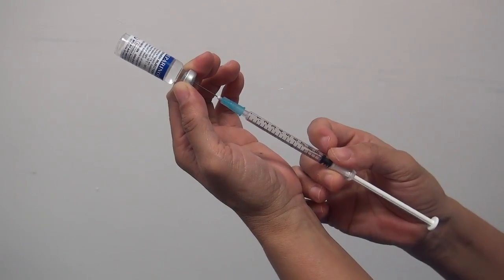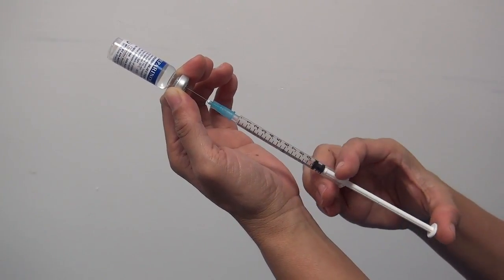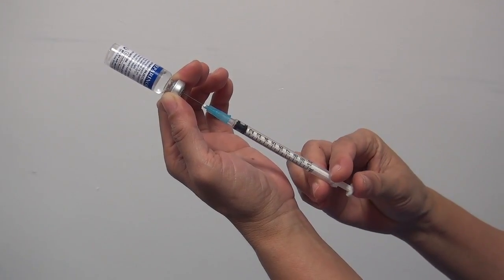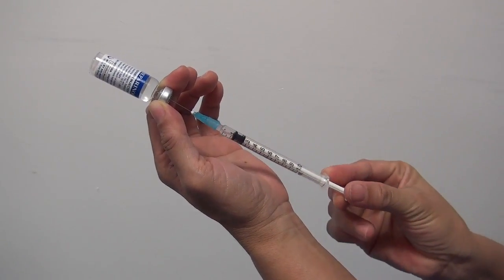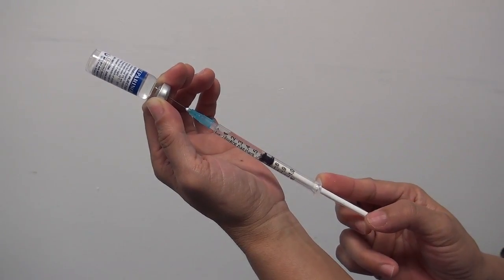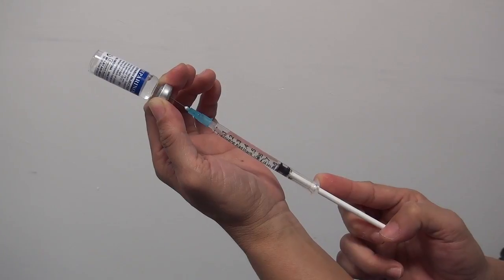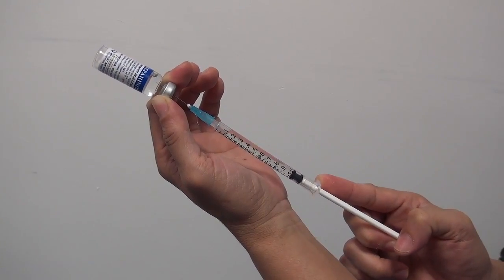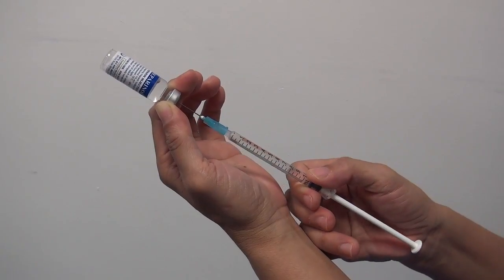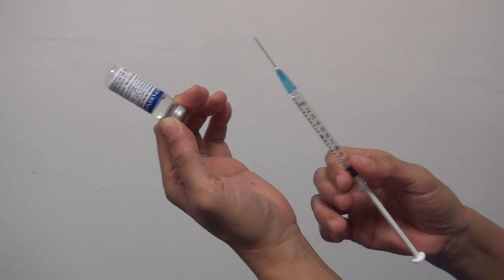Now, insert the needle perpendicularly into the vial via the rubber bung. Inject the air that was withdrawn earlier, and then draw out 1 cc of heparin into the syringe. Withdraw the needle and syringe from the vial.